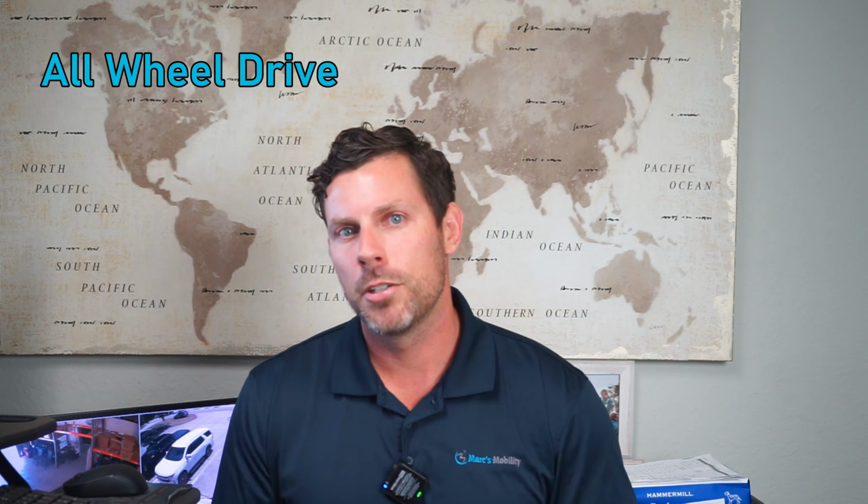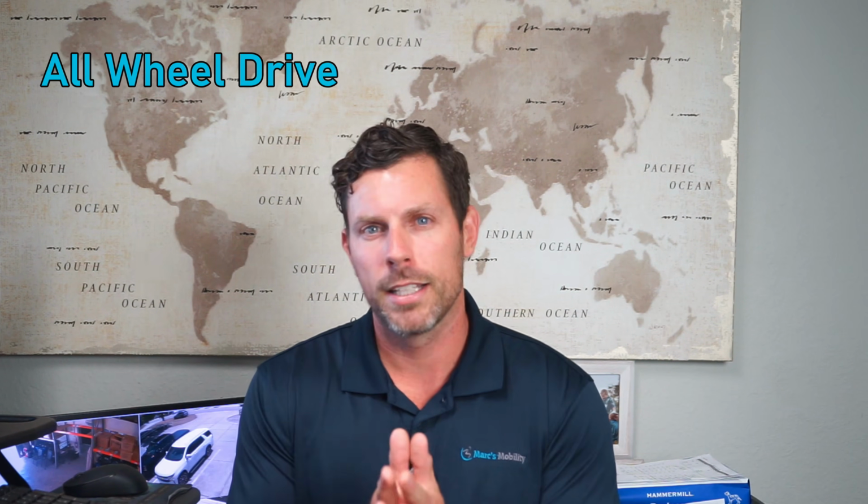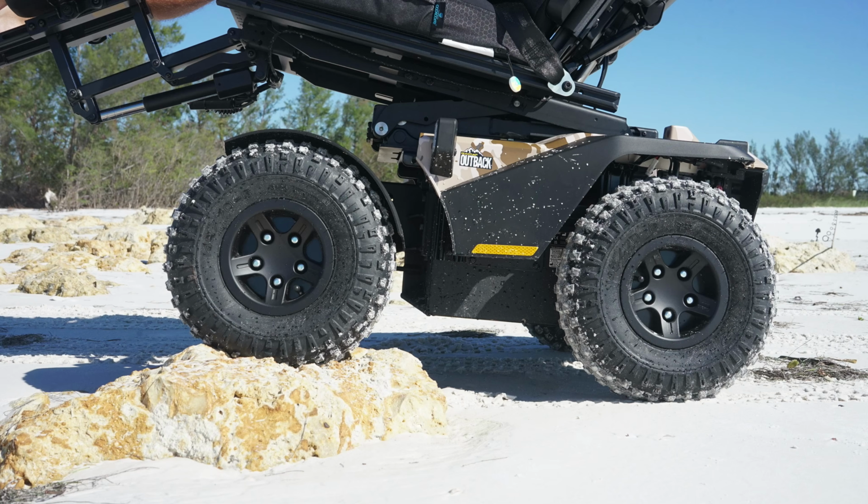And the last drive configuration that Quantum came out with about a year ago is what's called the Quantum Outback. We'll call that an all-wheel drive configuration. So it's a true 4x4 power chair. This is primarily going to be outside usage.